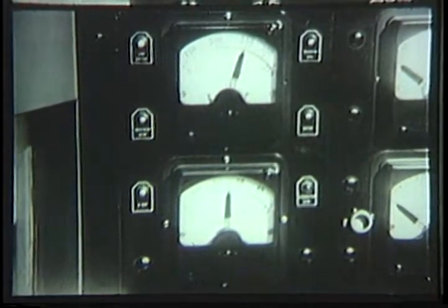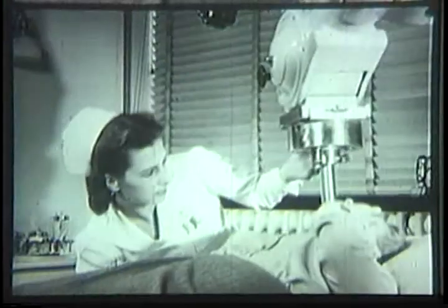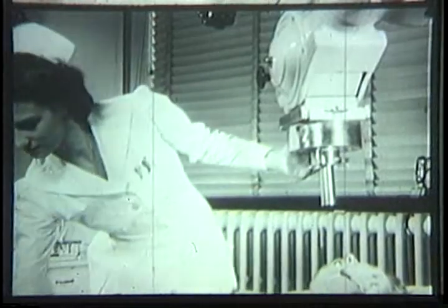When the exposure time is up, the machine is automatically turned off by the timer. Mrs. Gordon's first treatment is finished. The technician quickly lowers the treatment table.